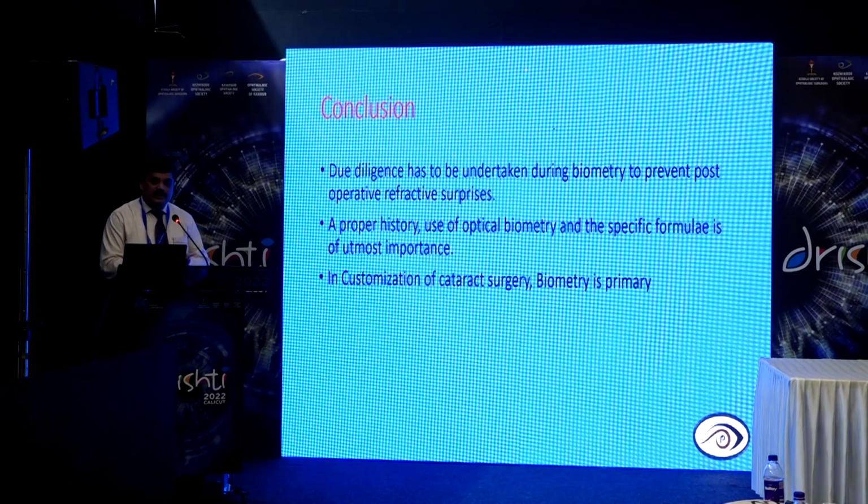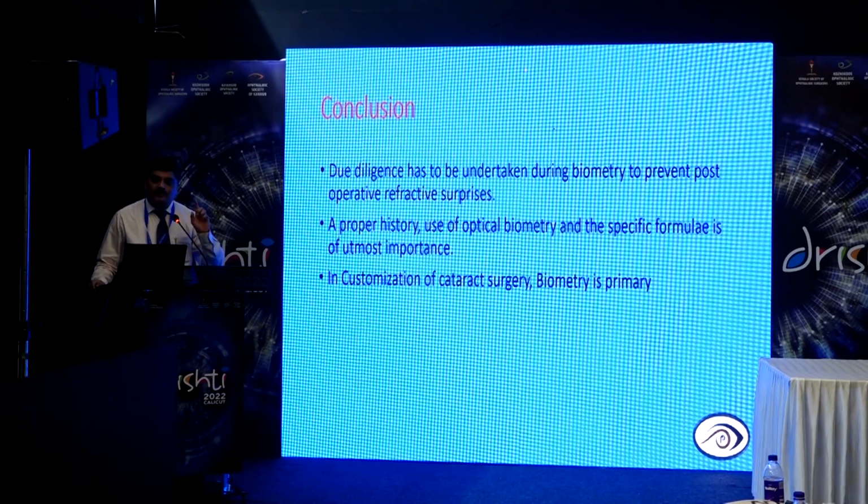In conclusion, due diligence has to be undertaken during biometry to prevent post-operative refractive surprises. A proper history and use of optical biometry and specific formulas are of utmost importance. In customization of cataract surgery, biometry is very important.